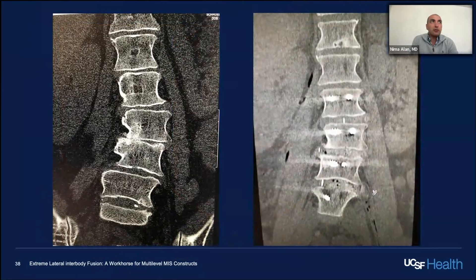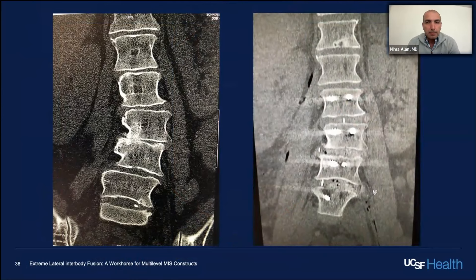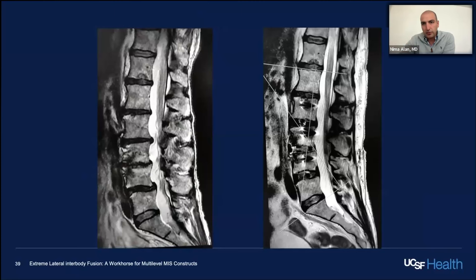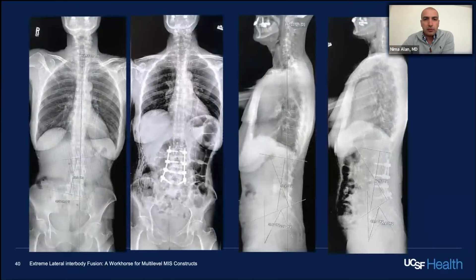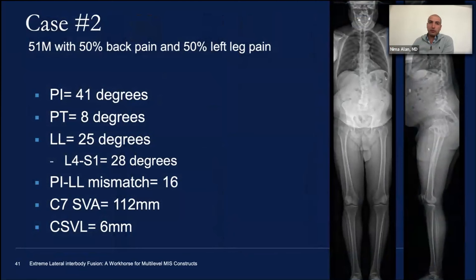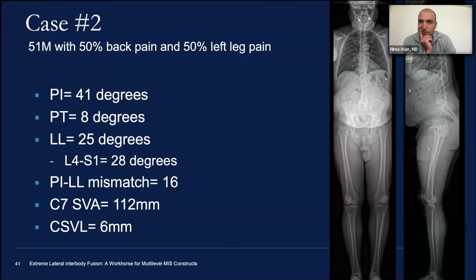This is especially true when the shift is towards the convexity of the curve. I also wanted to show the power of indirect decompression through ligamentotaxis — no direct decompression — and you can see even the ligamentum flavum buckling is improved by distraction across the disc space. We did not go to L5-S1 because it was preserved; going to L5-1 would have required extension to the pelvis.